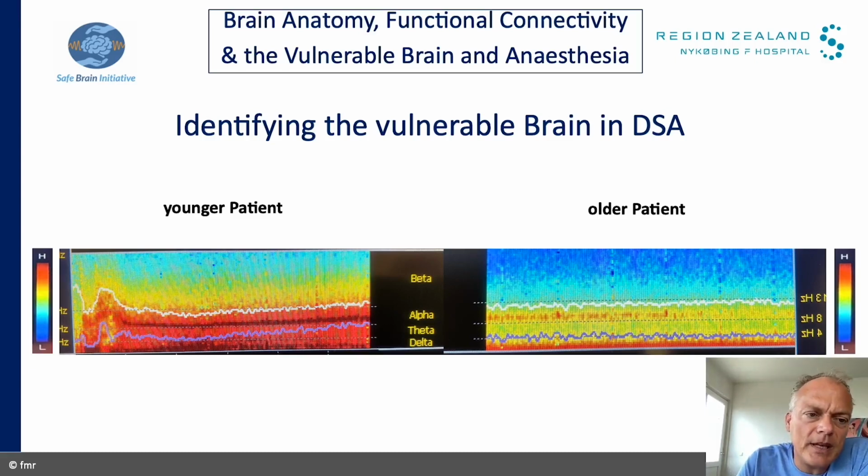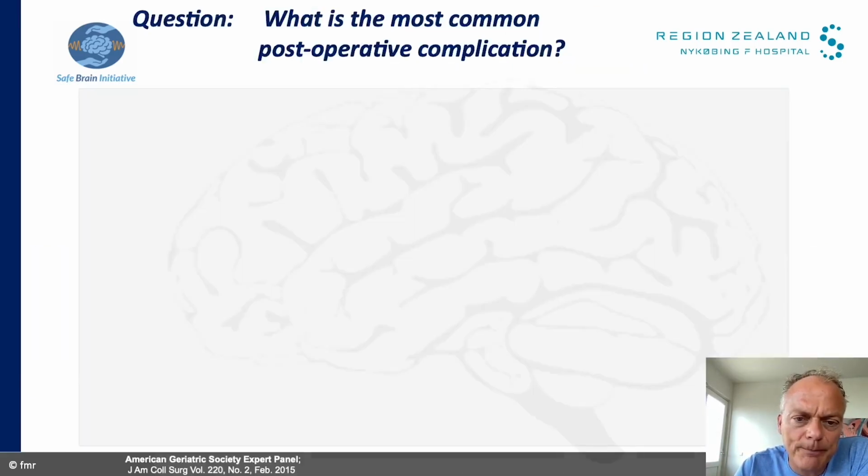Here you can see the typical DSA for a younger patient with a very strong response in the spindle or alpha dominant area, 8 to 12 hertz, and the same in the delta area, really deep red for high, above 7 decibel power in these areas, compared to the older patient, where you have very little alpha response and not very much delta response either. So by definition, you can already see in the DSA that this patient is in tendency more prone to burst suppression, or to being more sensitive towards the sedative part of anesthesia.